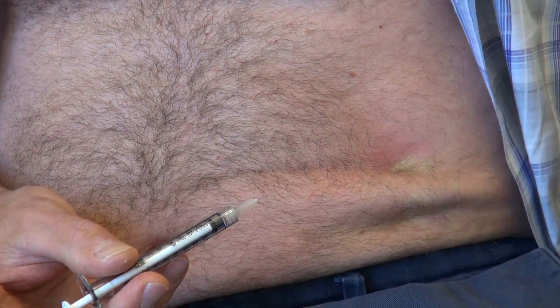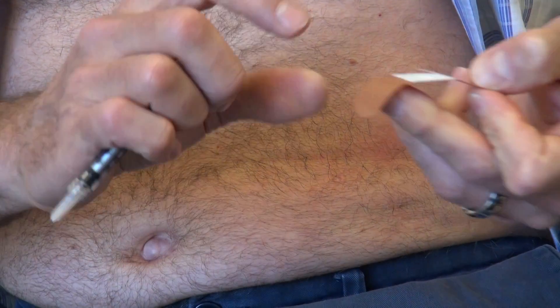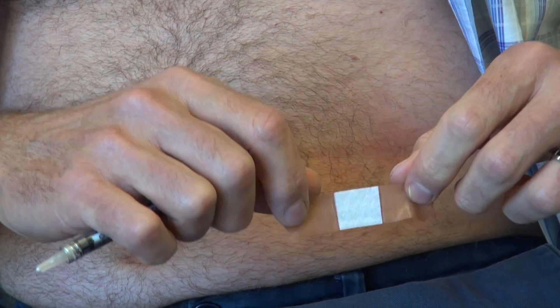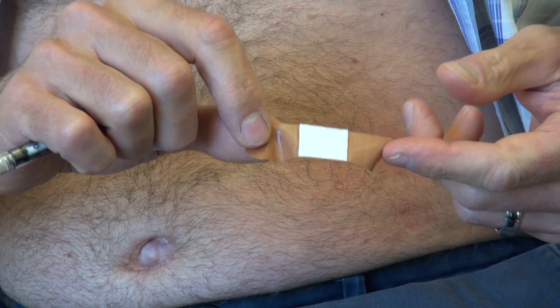If there is any bleeding, have a band-aid close by and put it on if needed. If you don't see any bleeding at all you probably don't need it, but it's good to have it nearby.